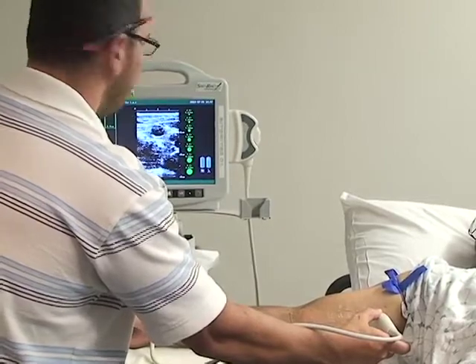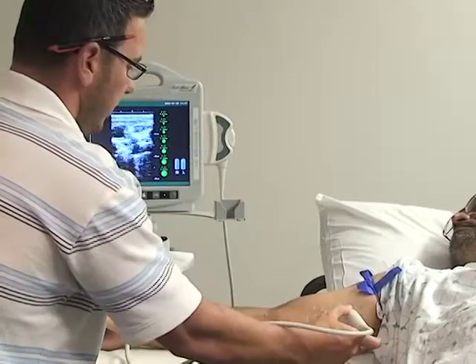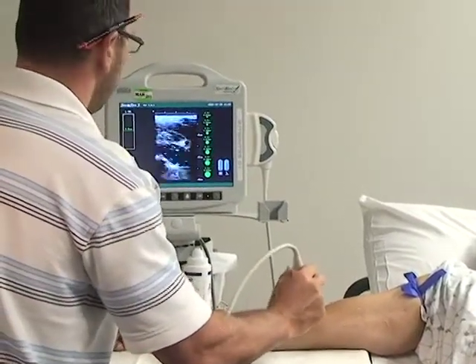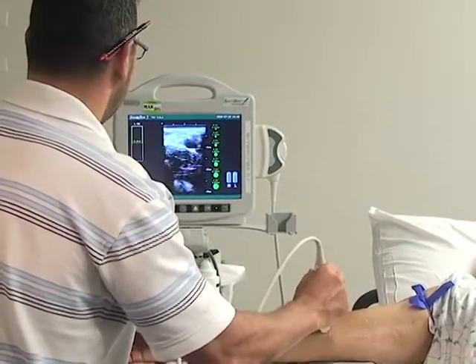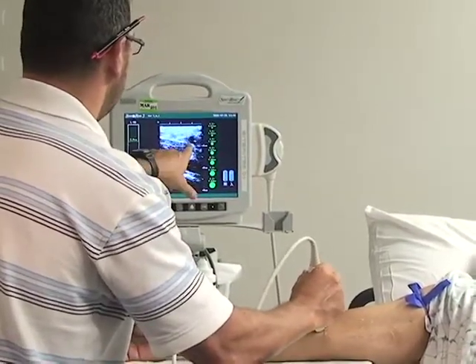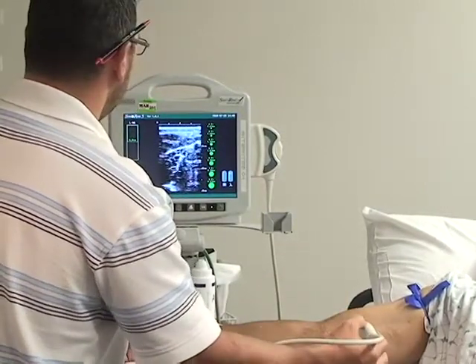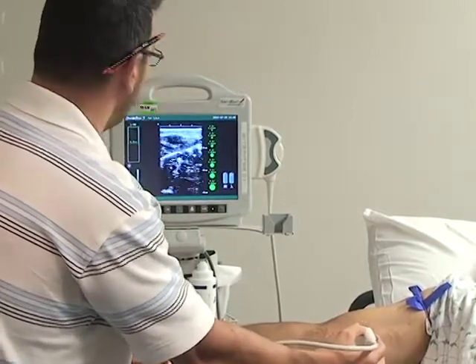Does anybody have any questions? Show me the brachial. Okay, so we'll go back down. You kind of know the brachial complex is in this portion of your arm here in the antecubital fossa, and it's right there. Again, you can see the artery bouncing. That's why it's so nice to roll over here. You get away from that whole complex and you find the basilic vein, knowing that there's no nerve and you're far away from the artery around here.